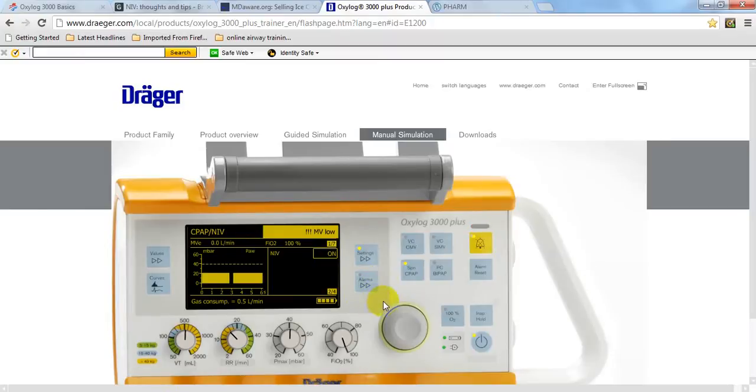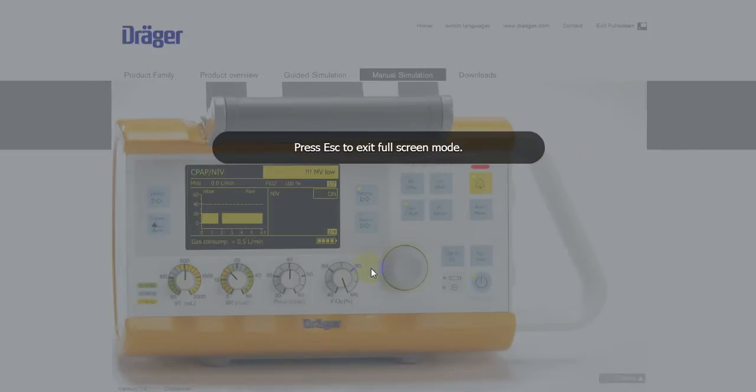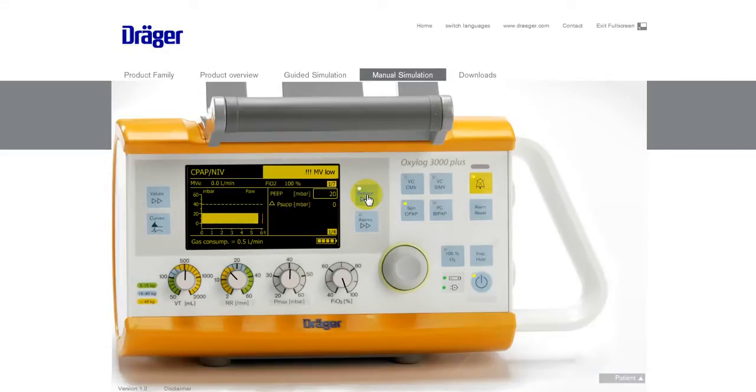Going back to the simulator to show the trigger setting: once pressure support is turned on, it gives you a trigger and a slope or ramp. The trigger can go down to 1 litre per minute but is automatically set at 3, so you can reduce it if the patient is really struggling and needs extra support to trigger with each breath. The slope or ramp is the way the flow of gas is delivered — just leave it on the default setting. There are really only two modes and it's not a big difference.